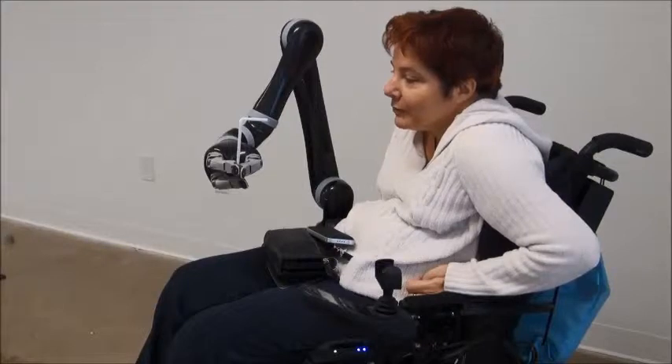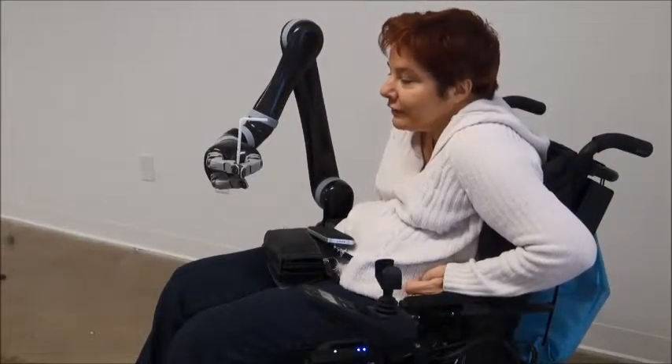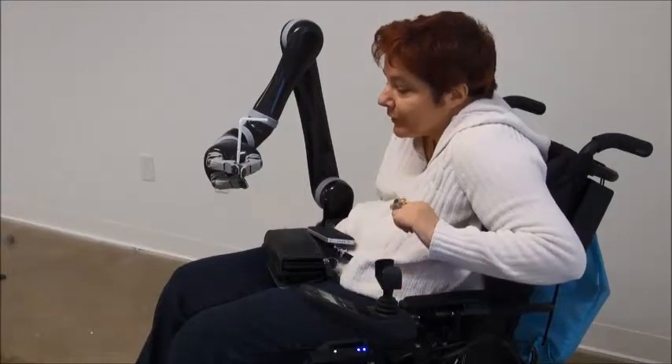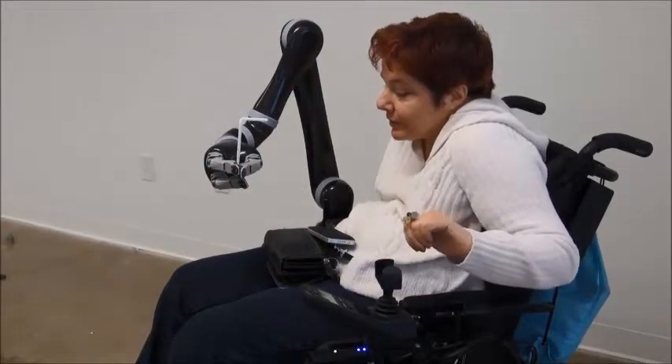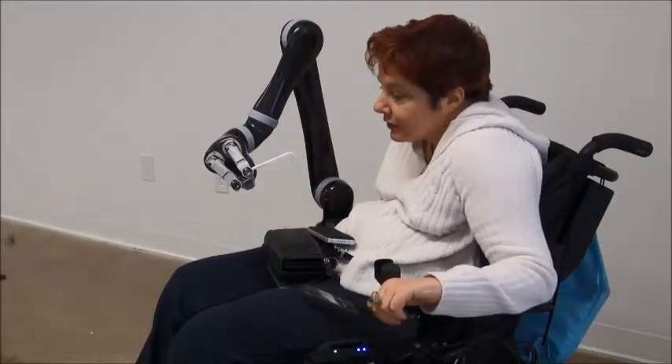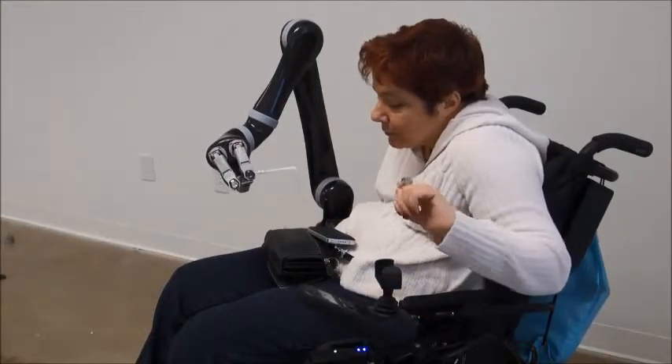Today, I will demonstrate the wrist rotation and the difference between the regular rotation and the drinking mode. First, right now I'm in the wrist rotation. As you can see, it's a very direct mode.